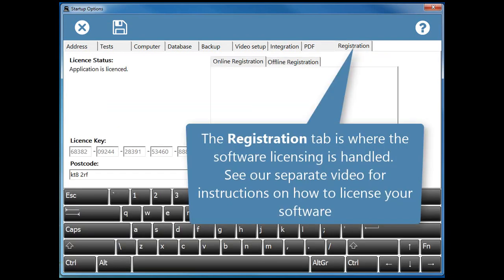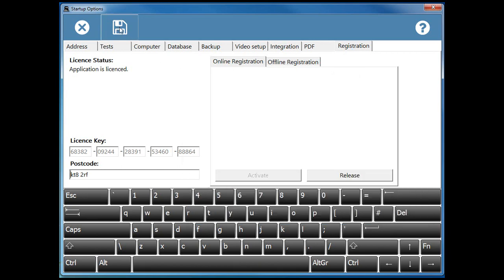The registration tab is where the software licensing is handled. See our separate video for instructions on how to license your software.